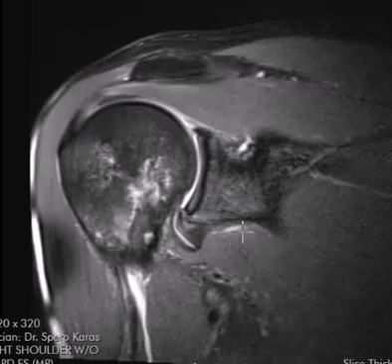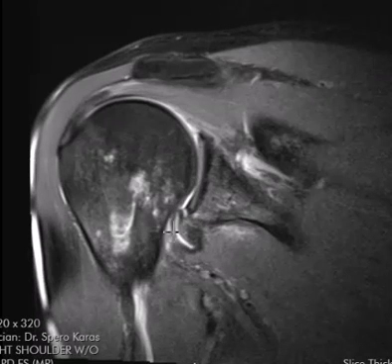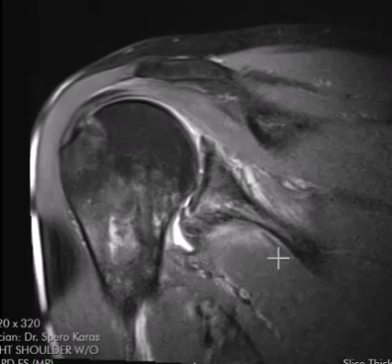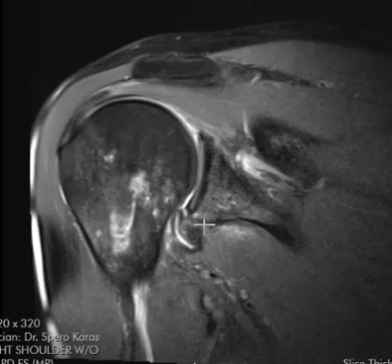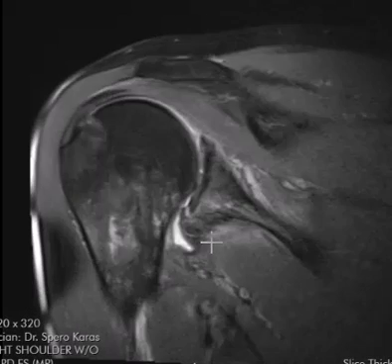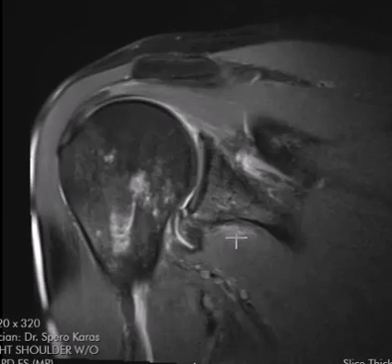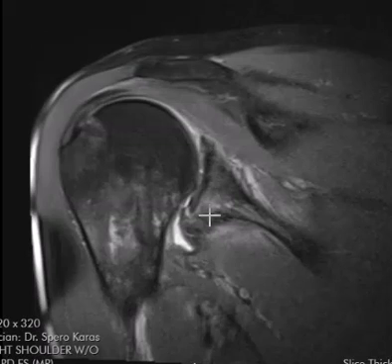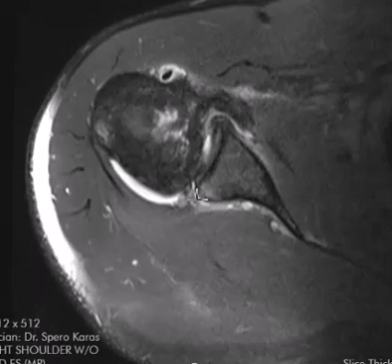Here's the middle part, and now we're getting to the posterior band, which comes down then back up. Right here where it attaches posteriorly, that posterior band is also partially torn — it looks a little thick at the attachment. You can see that labral tear right there. So a broad labral tear goes through the entire inferior labrum with an associated fracture of the posterior glenoid and injury to the posterior scapular periosteum.